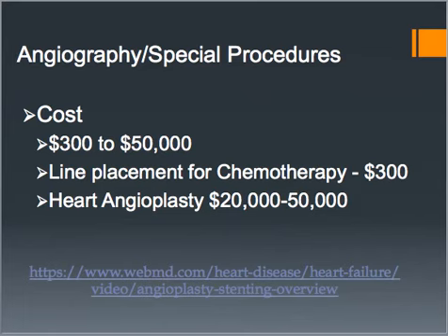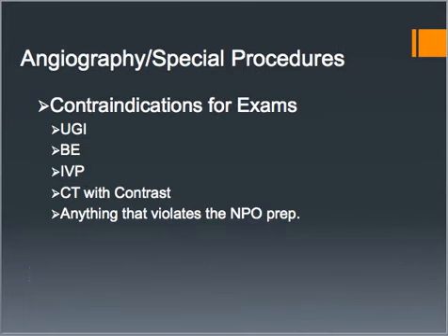Contraindications for the exam are anything that would violate the prep. For NPO prep, if there was a pelvic ultrasound where they had to drink 32 ounces of water, that would violate the NPO prep, so those couldn't be done on the same day. Or anything using contrast that would obscure what we're looking at. So upper GI, BE, IVP, or a CT with contrast would not be allowed on the same day as the angioplasty or angiography.